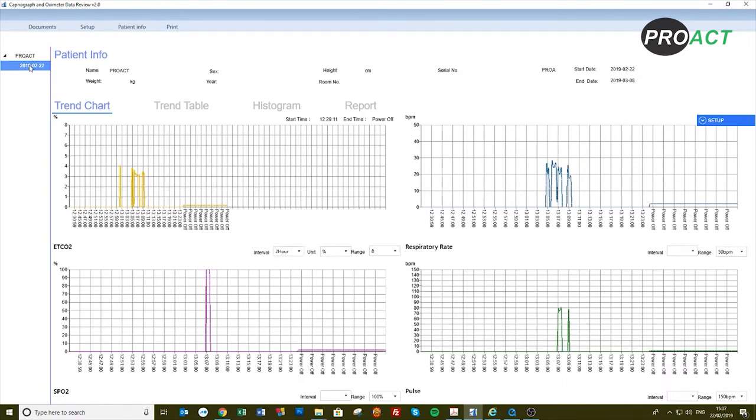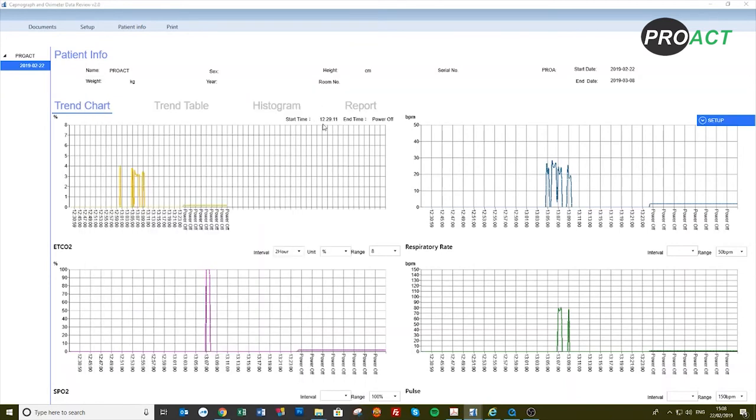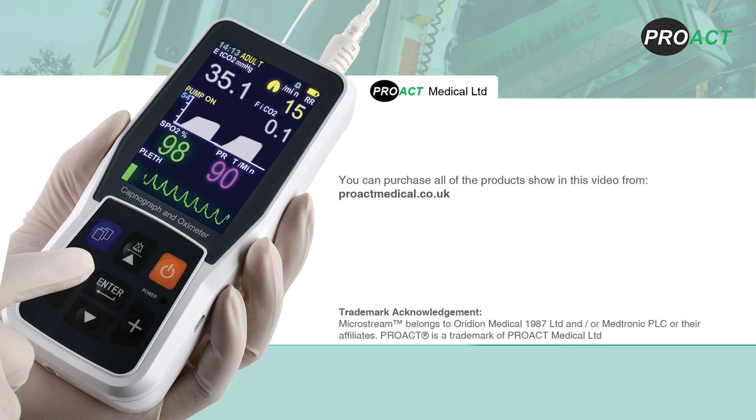To print your data, click on the selected date and print as shown. We would like to remind you that this is a demonstrative video and it is to be used in conjunction with the user manual. We offer telephone and email support and will be pleased to assist you. You can purchase all of the products shown in this video from www.proactmedical.co.uk.